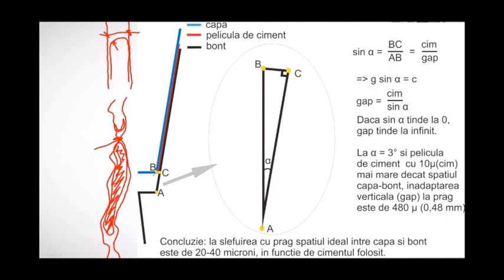Before cementation, it was okay. After cementation, the patient says, oh, I feel a little bit. And the dentist says, oh, you go home and you don't feel it. Yeah, right. Or you trim. You trim and you say, well, that's it. I don't know. Now it's okay. Yeah, it's okay. Go home. Yeah, that's not the right way to do it.